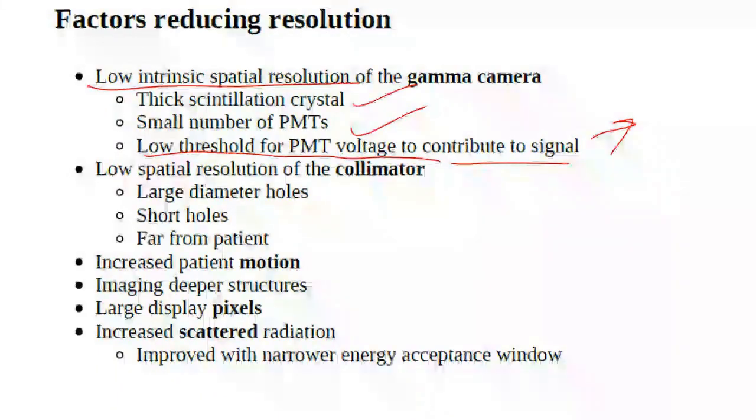The photomultiplier tube must be capable of handling 3 distinct thresholds in the process of acquiring the incoming light photons or signals to ensure accuracy. This threshold level should not be too low, so that if there is significantly high energy from gamma photons, it can convert them into an appropriate electronic signal or voltage signal without compromising detection efficiency.